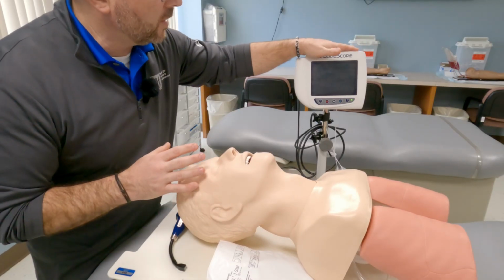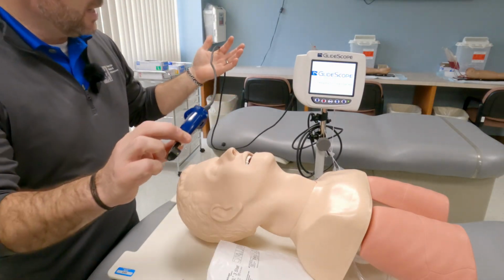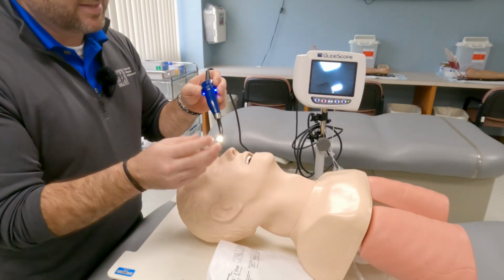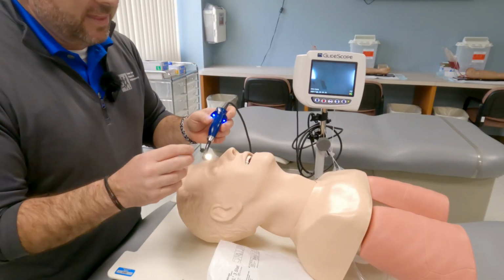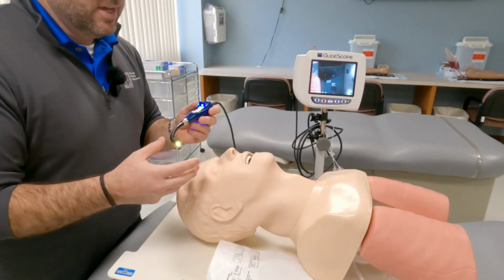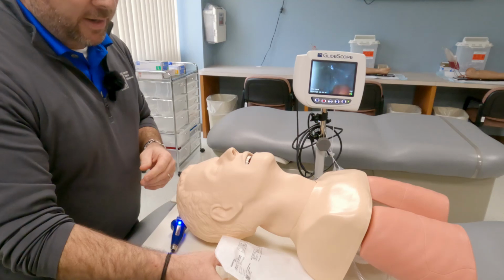First of all, we're going to turn the device on. On this device, you're going to see it comes out, it has a camera on the end. On the end of this camera is a light. Obviously, you need a light. It's a dark area down there. And then the tip actually warms up a little bit. When the tip warms up, it allows it not to fog when it goes inside of the oropharynx.